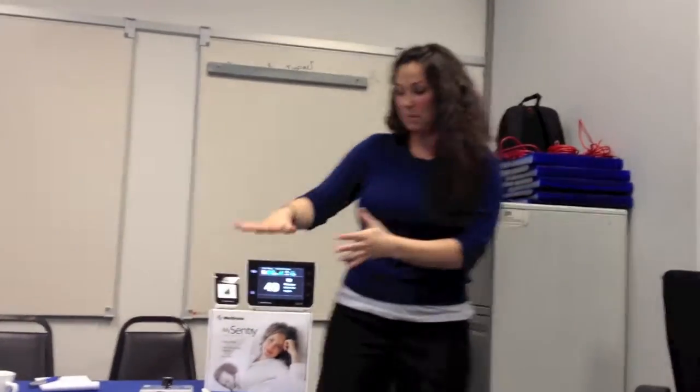Can you have more than one outpost? Like, can you have outposts everywhere so your whole house is wired? So with the system, it's a 1-to-1. So it's one outpost to one monitor. So it's one system to one pump. Does that mean today? Okay. Today, exactly.